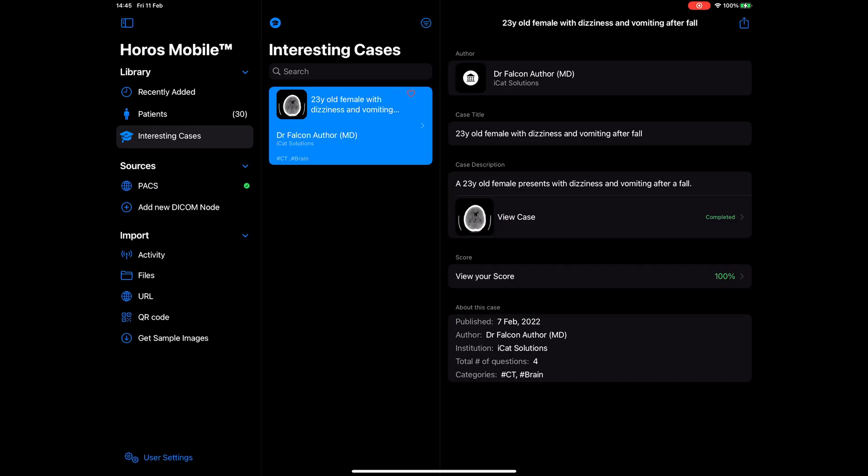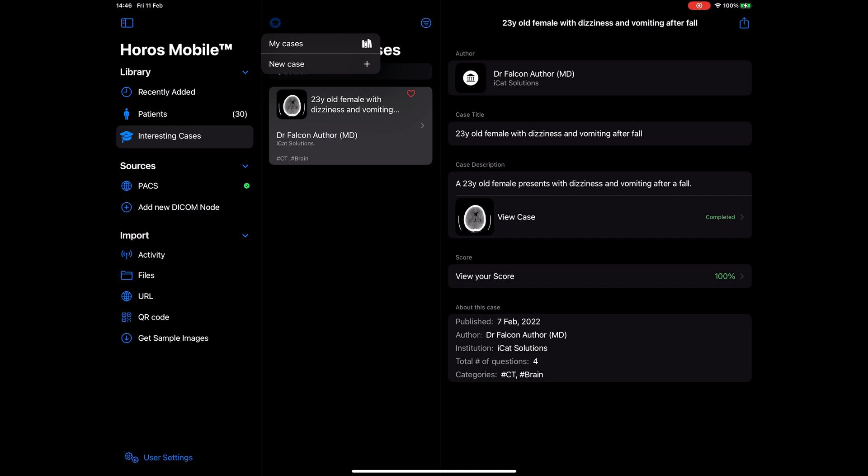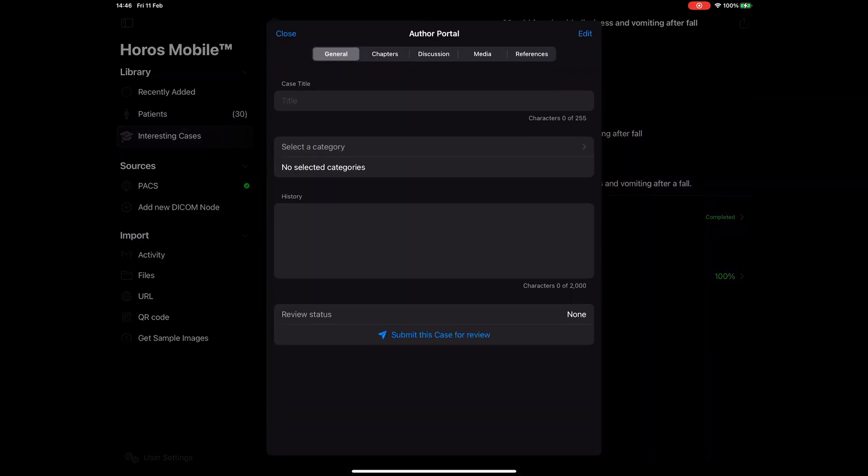From this panel you can view, publish to the app, and view your cases or create new ones. Let's create a new case.